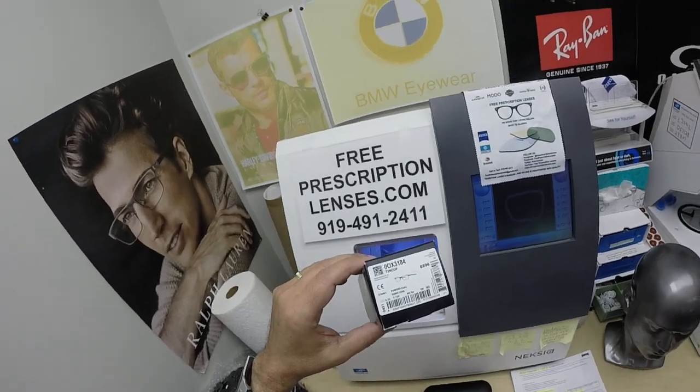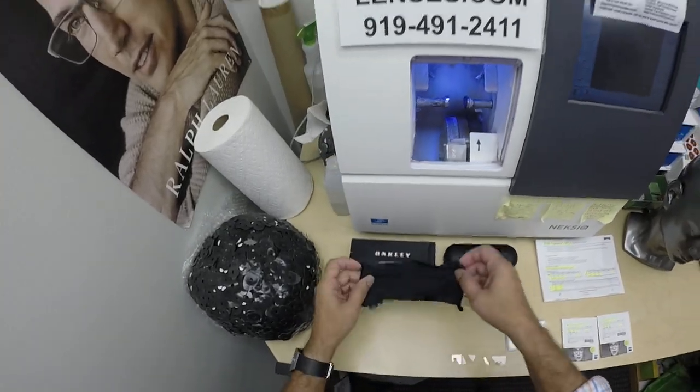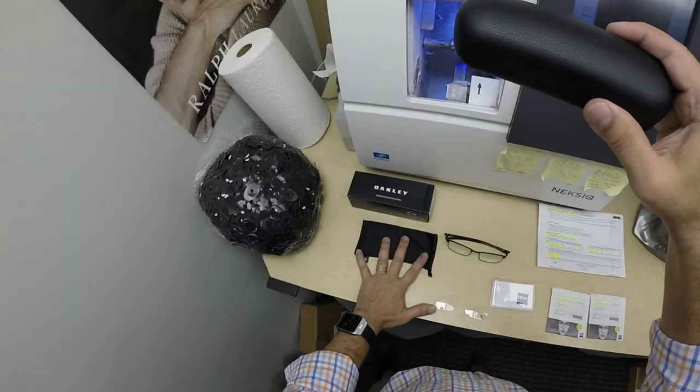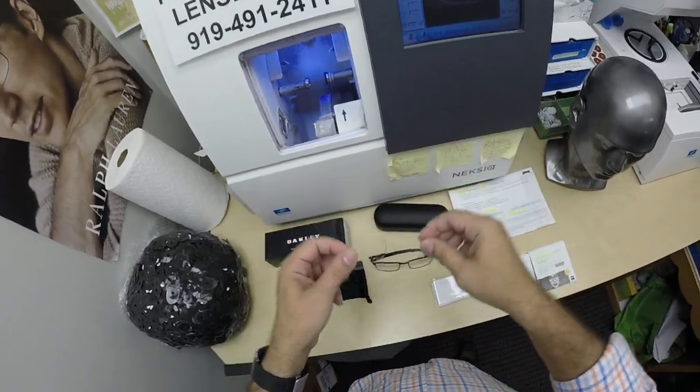This frame sells for $303 complete with one free pair of clear single vision prescription lenses or non-prescription lenses. It comes with the Oakley cleaning cloth and carrying bag, as well as a hard case you can carry it around in — the Oakley hard shell case — and you get the original demo lenses.